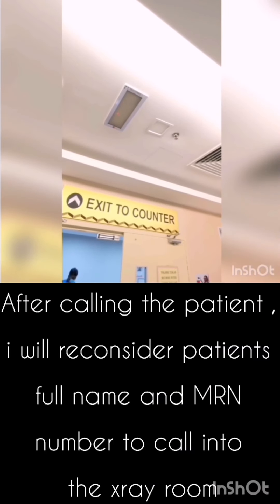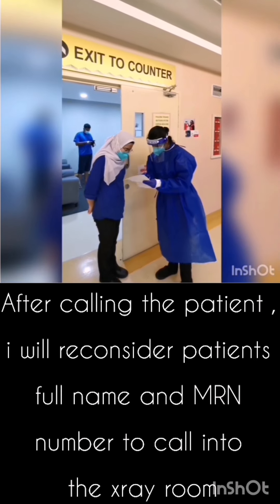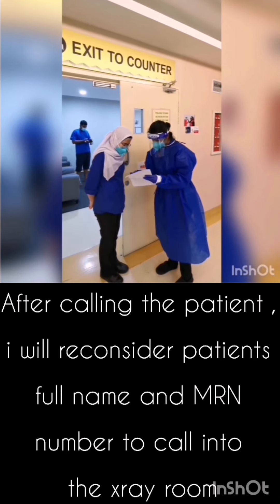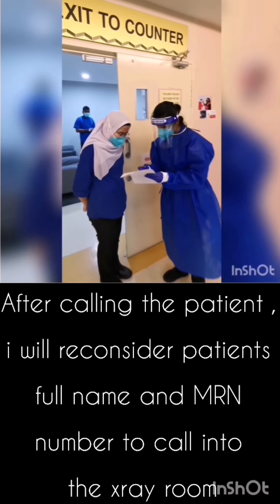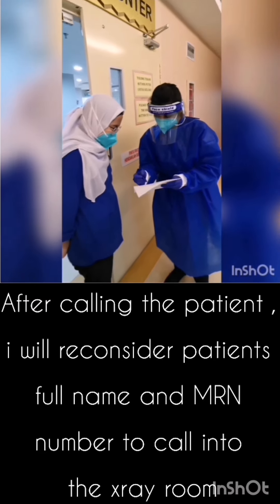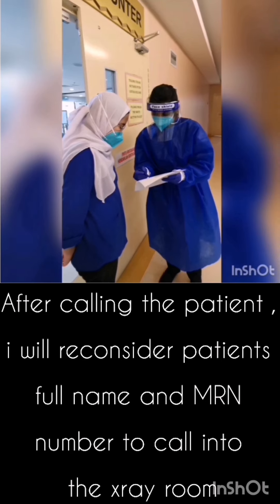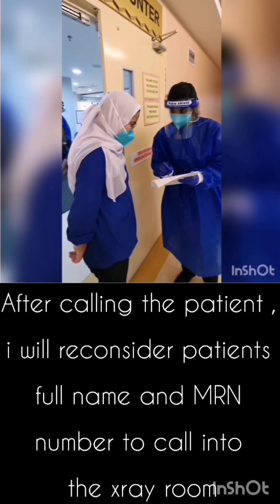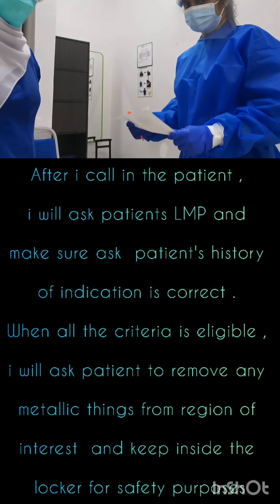After checking the case, I will call the patient and again ask for her full name, MRN, and her ID to confirm the patient is correct. Next, I will bring her to the x-ray room.